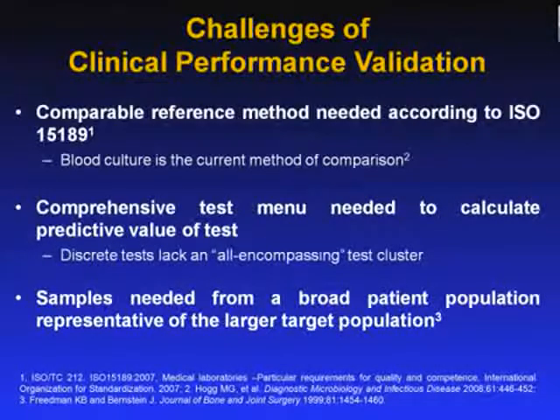Most hospitals use the blood culture method, but there are problems associated with blood culture as well. For example, blood culture is limited by existing antimicrobials, inoculum level, and pathogen growth characteristics. It also demonstrates a slow turnaround time, and although rigorous cleaning protocols have been established, contamination still occurs. However, blood culture does possess some clinical utility characteristics that nucleic acid recognition does not. For example, a broad, nearly comprehensive test panel.